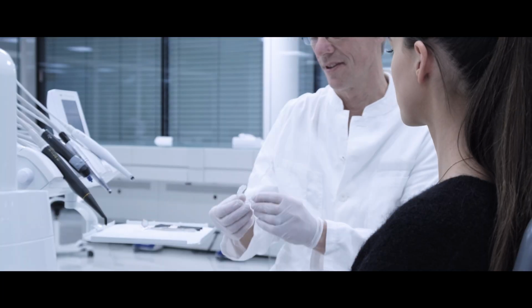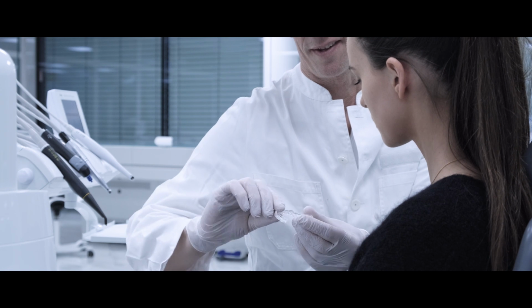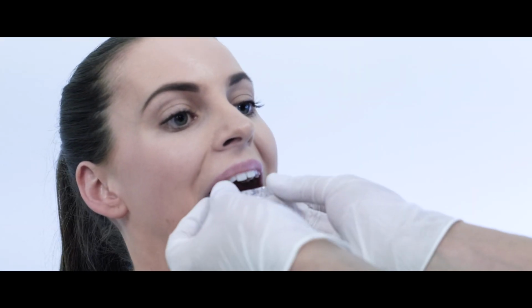The dental technician, proud of the work done, delivers the Zirkonzahn box to the doctor, who proceeds with the fitting in the patient's mouth and with the final direct adjustments.